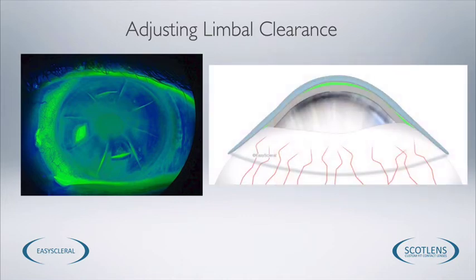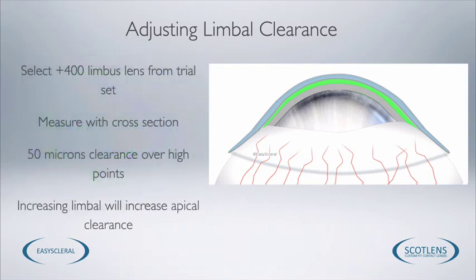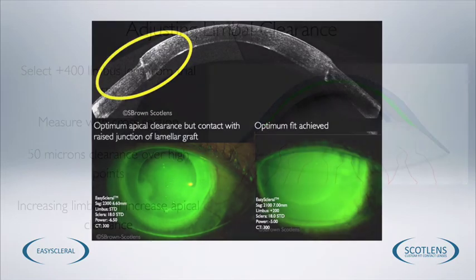So in the fitting set, we have some lenses that have increased limbal clearance by 400 microns. So one of those lenses would be inserted, and that would allow us to provide a good fit without any peripheral corneal contact. We sometimes also need to increase the limbal clearance in graft patients.